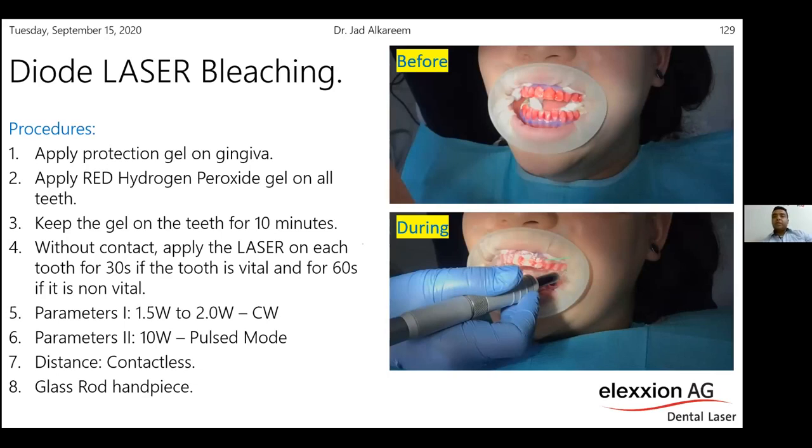26 minutes. But with the normal bleaching devices that you use in your clinic, it can take up to 45 minutes depending on your device. So with the laser, it takes much less time, and it also has less sensitivity or less discomfort after the treatment compared with the normal bleaching devices, because the diode laser also has an effect to treat the hypersensitive tooth.